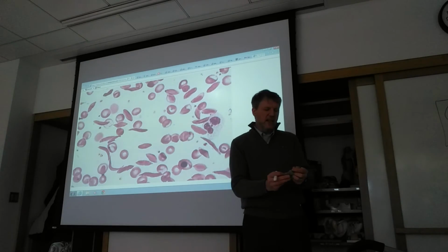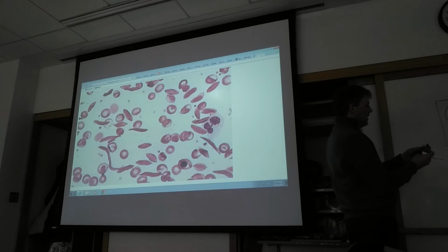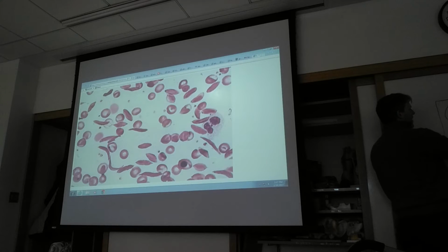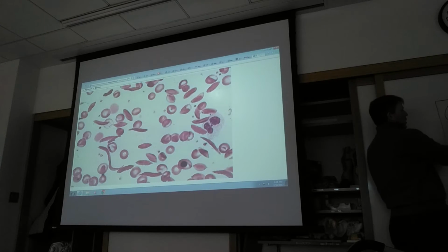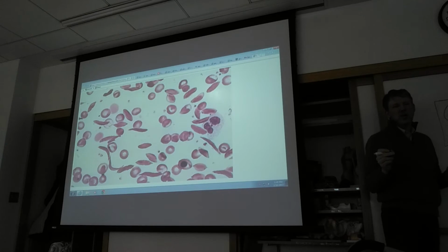These chemicals are called anti-sera or anti-serum. And you want to read what the label says. There's an anti-RH one. You're going to want to put a drop of that and mix it with the blood that's in the RH spot. There's another one that says anti-A. You drip that into here and then mix it up with a little toothpick that they have. And then there's the anti-B one, and you drip it into there and mix it up. Make sure that when you mix it up with the toothpicks, you don't share the toothpicks between them. Use a fresh, different toothpick each time you mix.